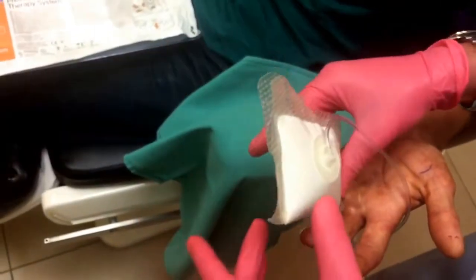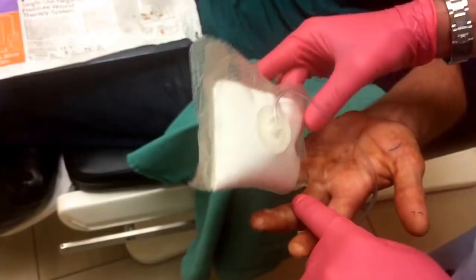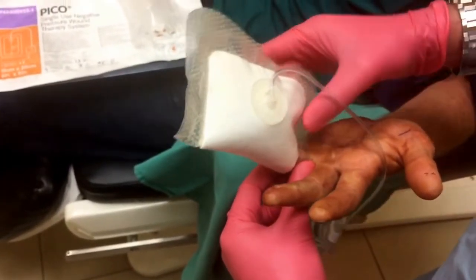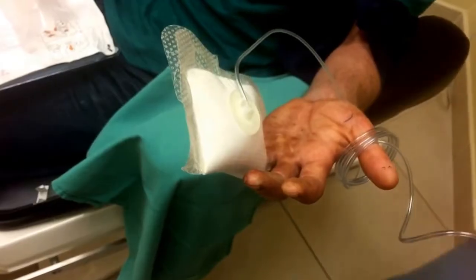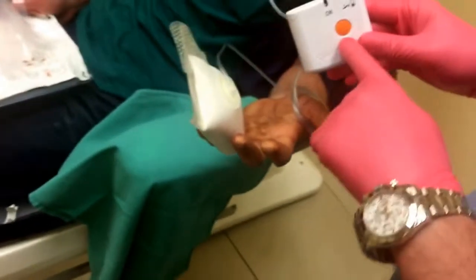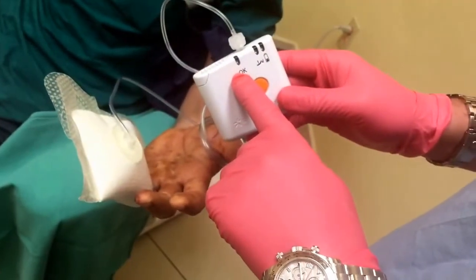As long as you have these adhesive parts down. I put Benzoin — that's the brown stuff, it's not blood. Okay, now if we connect it — which we're going to connect right now. We may have to get new batteries, but you press the orange button. If it turns green, then it's good.